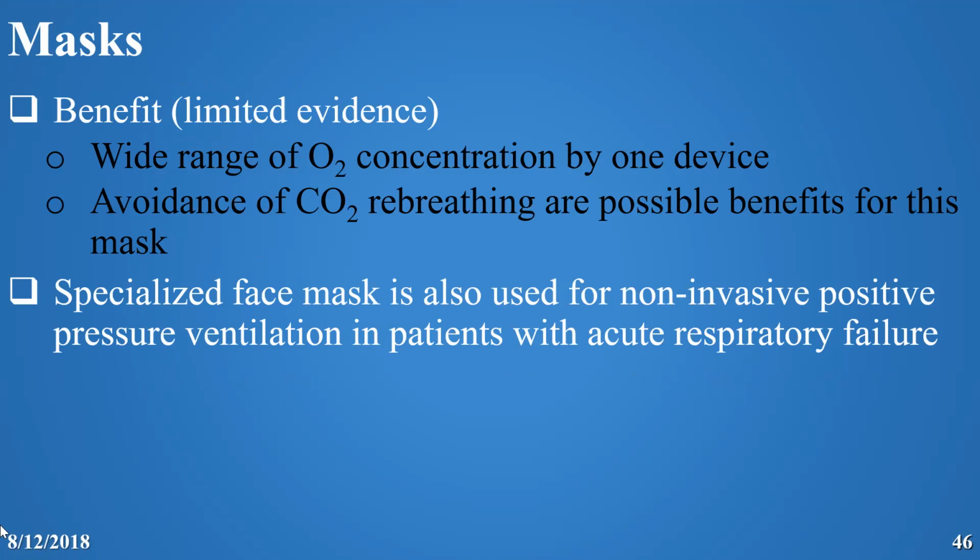What are the benefits of the mask? We can give various concentrations of oxygen in one device, and we can avoid CO2 by preventing the rebreathing. That's the benefit of the simple mask.